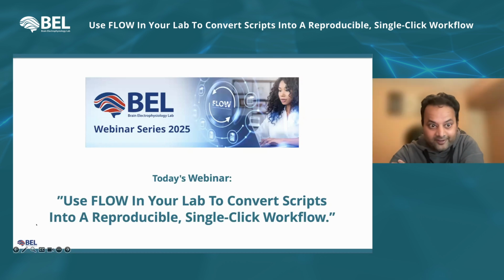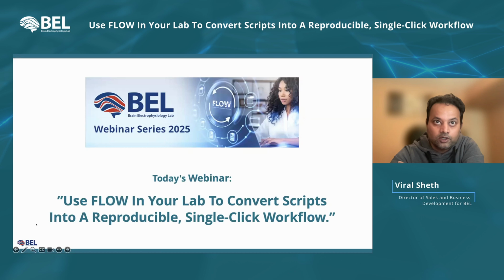Dr. Lorenzo, thanks for the great presentation. Same to you, Roma. I had a quick question. I don't know if you discussed the extensibility of your pipeline. I know you've been pioneers in infant and pediatric research over the years, but I wonder if you have any comments on the extensibility of your pipeline for adult work as well, for a lot of researchers that are doing adult EEG, ERP research. What's your thought on the usability of your code towards that work?